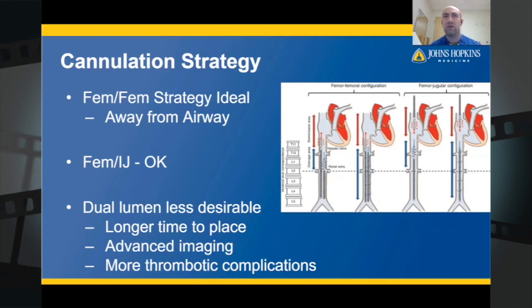The dual lumen cannula should be avoided if possible, as they take longer to insert. They're usually associated with higher risk of thrombotic complications and malpositioning requiring repeat echocardiography with associated increase in resource utilization and personnel exposure.